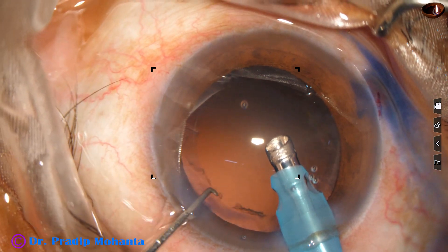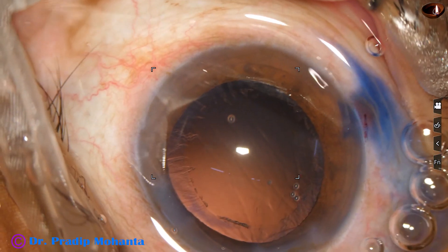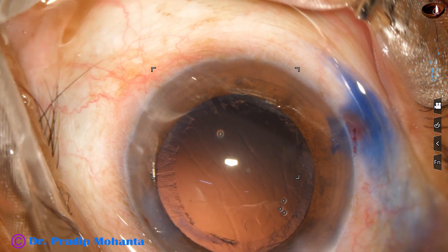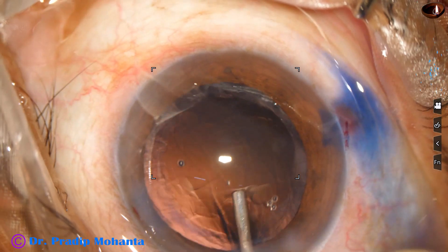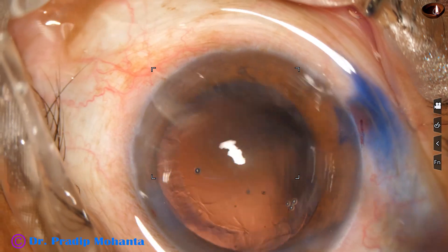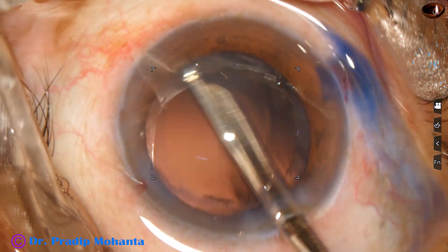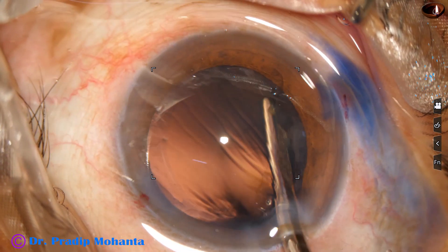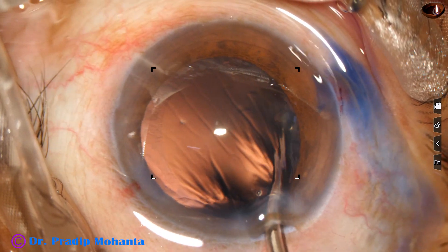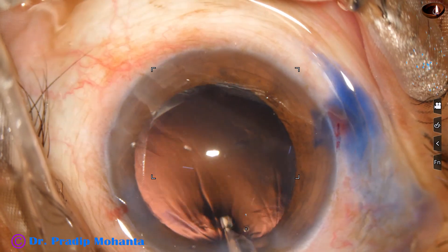The nucleus has been nicely managed. Now a bit of Viscoelastic is injected into the anterior chamber, and then a Simcoe cannula is used to remove the cortex. Most of the cortex is removed going through the main incision.